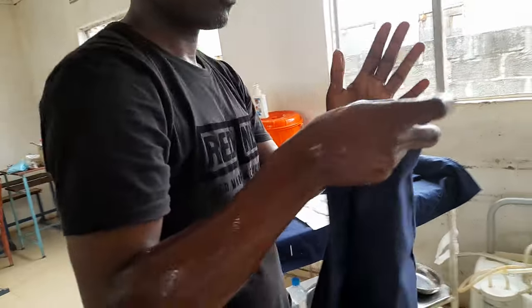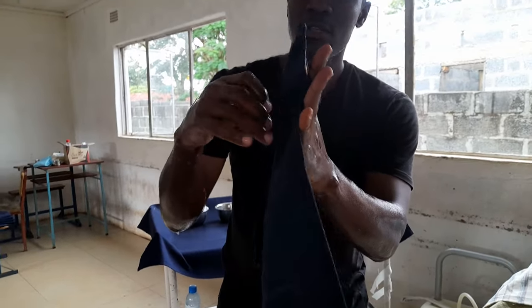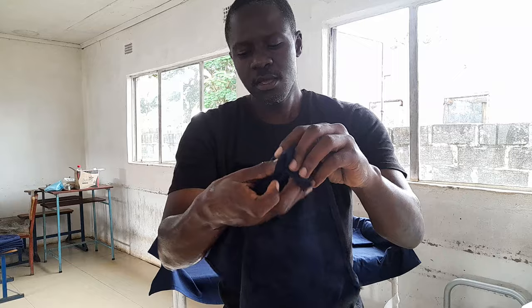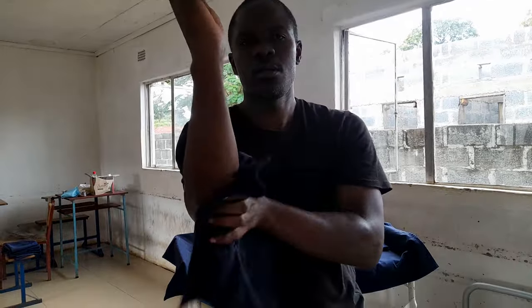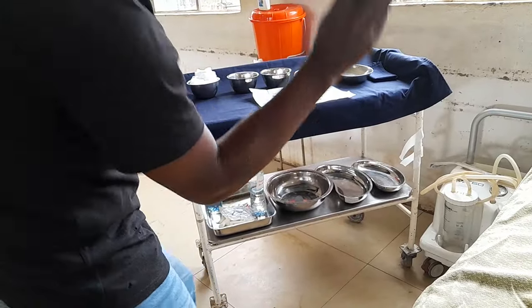Then go to dry your hands and arms using the sterile towel. Start with the first corner, making sure your fingertips are dry, then work up to the elbow. Swap to the second corner for the outside, the third corner for the inside, and the fourth corner for the other outside. Once done, throw the towel into the receiver — bend slightly and toss.